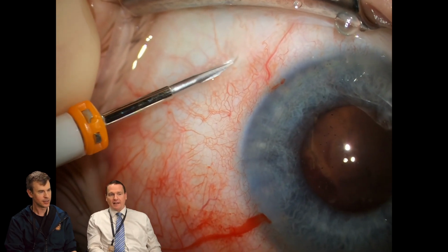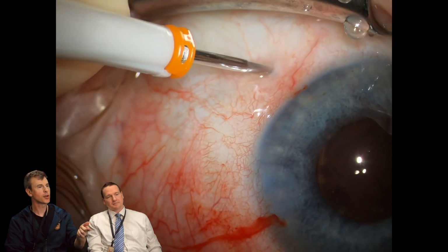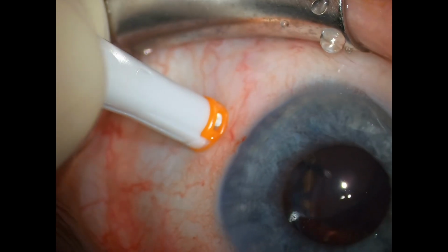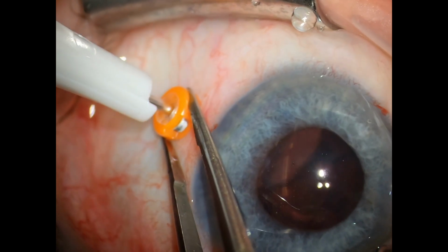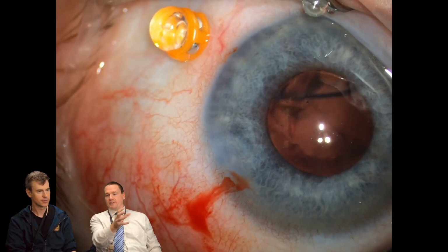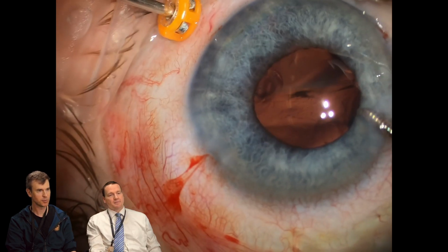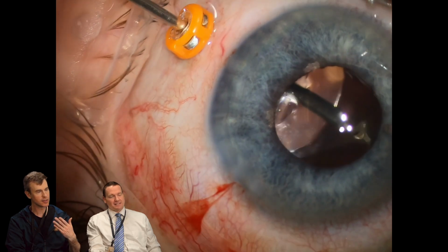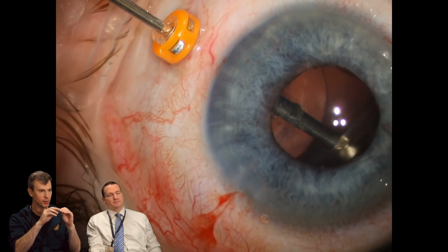And now you're going through the sclera. And you might have seen a little bob early on where the lens was. This is a trocar that's placed into the sclera underneath conjunctiva to do a vitrectomy, remove the vitreous, and there's the lens. Comes into view as the trocar pushes from behind. This seems a little dicey to me because now it doesn't seem like it would take much for that lens to fully move even further back into the eye. Correct. I am not particularly comfortable at this point, but I fortunately am able to push the lens, since I know where it is, into the front and able to hold it and grasp it with a little forceps.